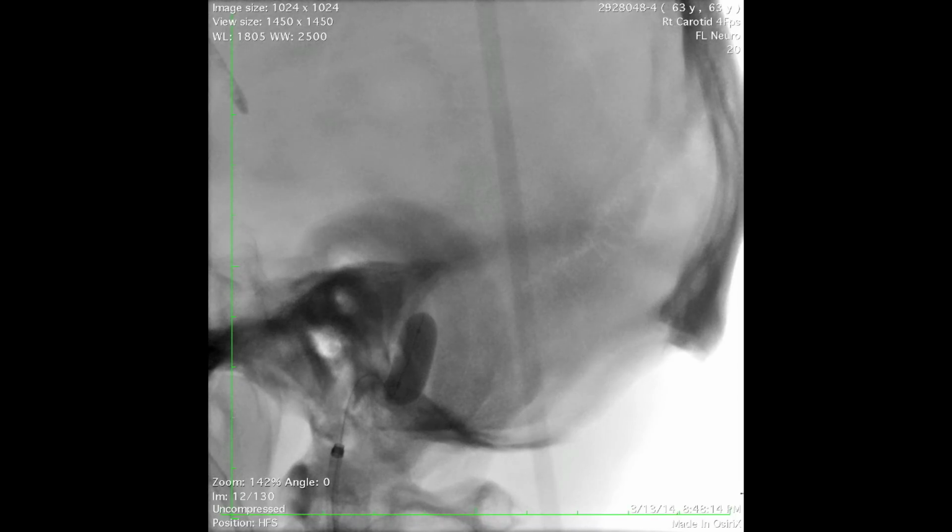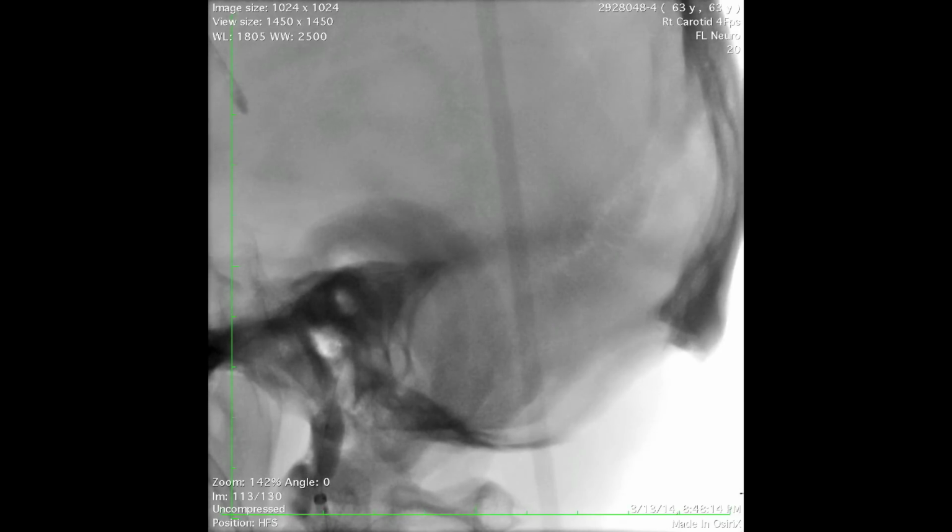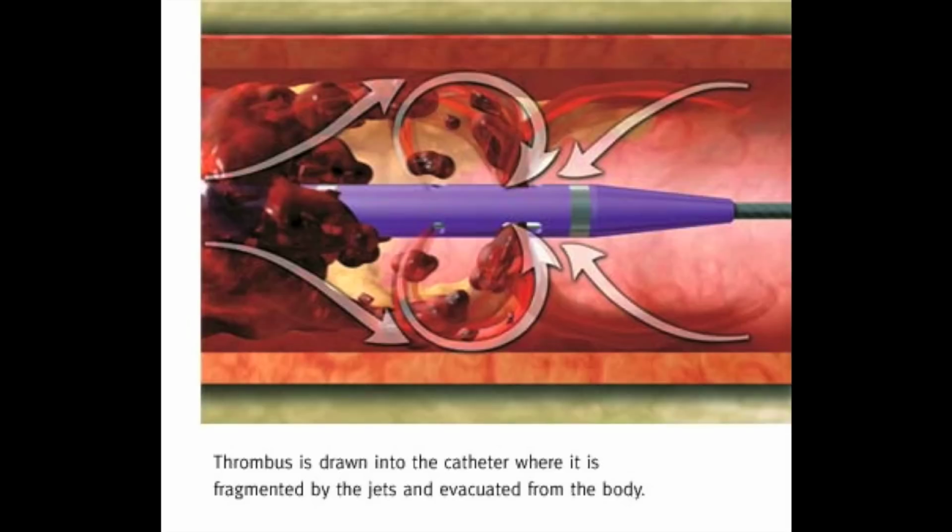with it. It's a procedure that's used by the body IR people in the peripheral vessels, and again, this is a last resort thing in patients who have a lot of clot burden, and this way the clot can be pulled into the catheter, but there's a risk of causing pulmonary emboli, which are small, but again can be useful.